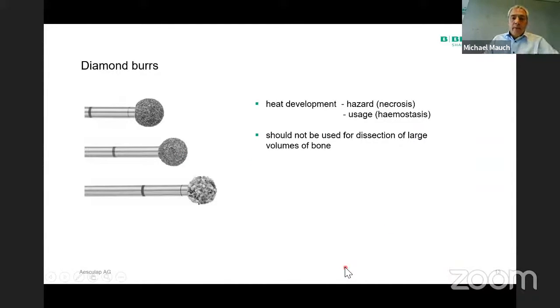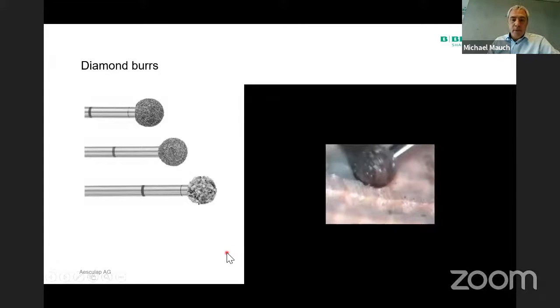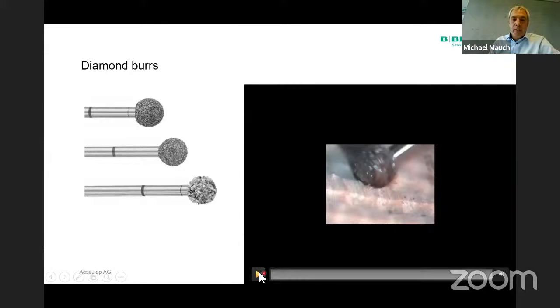So the diamond burrs, they do not really cut, they rather dissect the bone by grinding. And this is the reason why they create so much more heat than fluted burrs. And there is a little impression of how this looks under a high-speed camera.